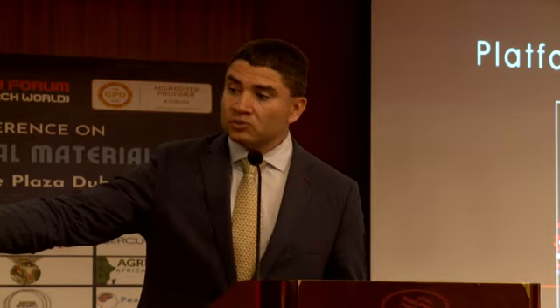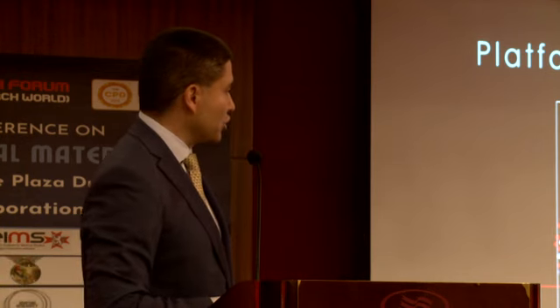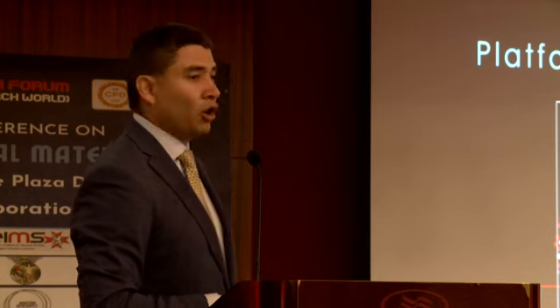But what happens with something that you alluded to this morning, the subcritical contour? Subcritical contour is key for success, not only for the emergence profile and long-term stability of your restoration, especially in the aesthetic zone, but also for the soft tissue thickness that will offer the protection for the physiologic bone loss.